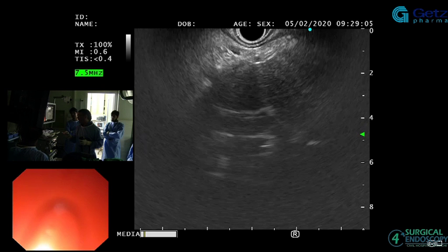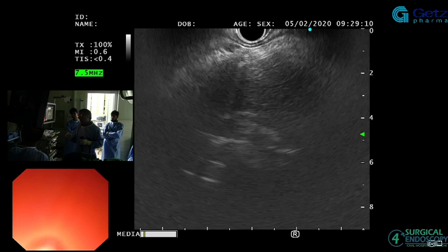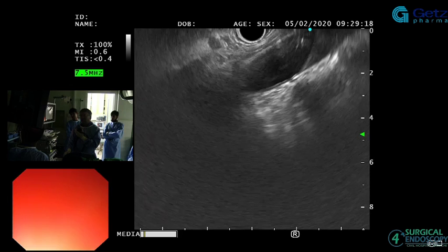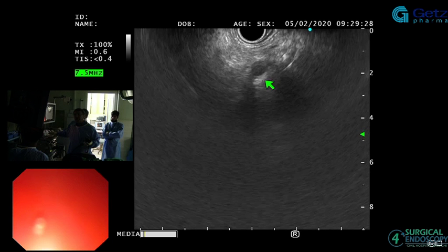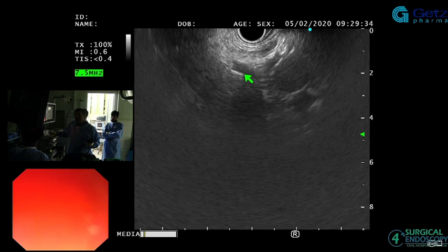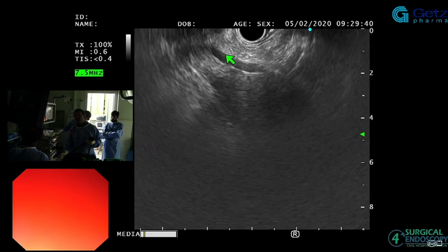And I'm going to show you just the whole pancreas right now, the EUS. I'm right at the GE junction. You can see the aorta right there. You see the celiac takeoff right there. And when I go to the celiac, you see the left gastric coming off right there. That's the left gastric going towards the right of the screen. I'm going to follow the splenic right there, following the splenic, and that takes me straight to the pancreas right now.